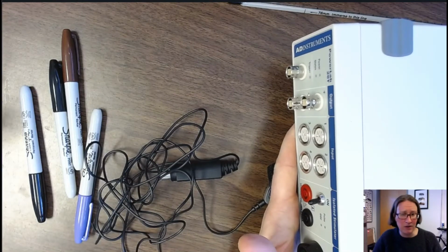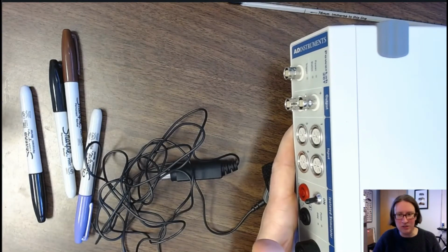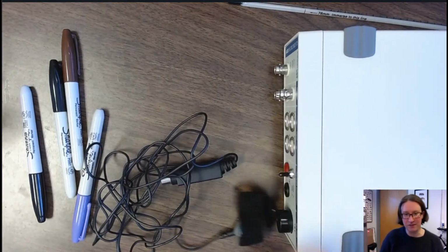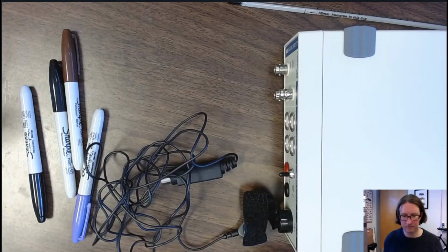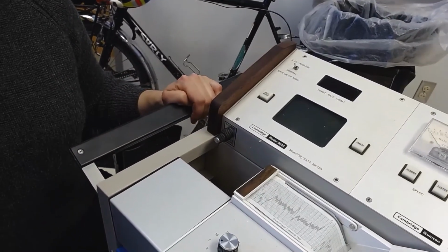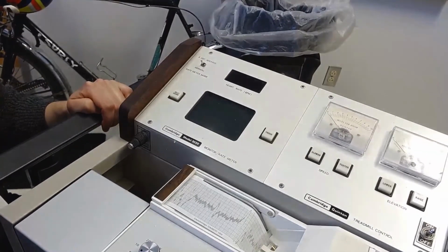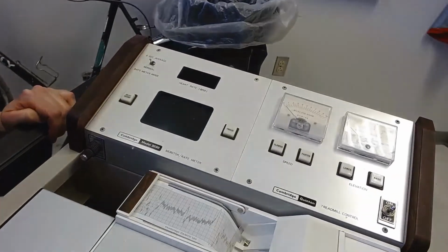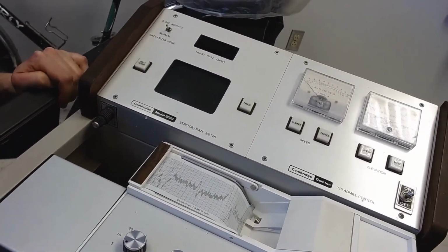Before we look at the Power Lab in greater detail, I also want to briefly show you the old school way of doing things. So here, right here, I have got a vintage EKG. There's a piece of masking tape on the front of this thing that says that it's from 1976.